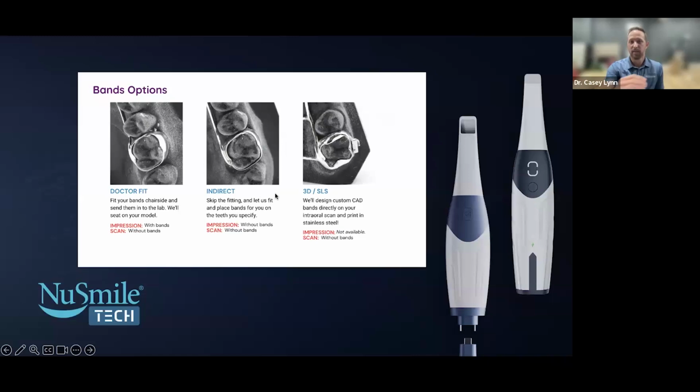Now, band options. When I started, I was still doing my doctor fits. This is what I've always done. That's what I did in residency, as an associate, and when I opened my practice. I always wanted it to be fully formed to fit. With this, if you are doing doctor fit, you will put the bands in, fit them, then take them off, scan, and send those to the lab for them to put it on.